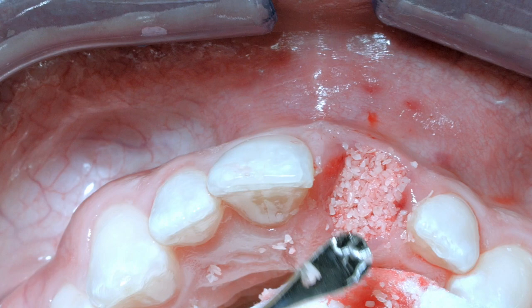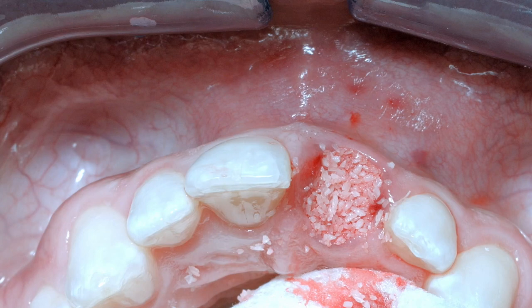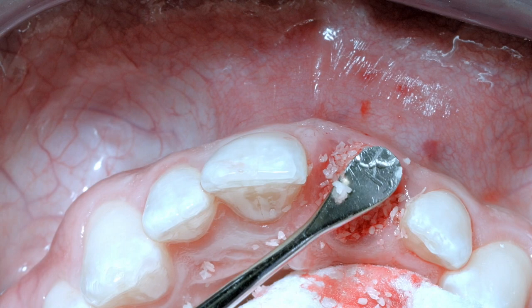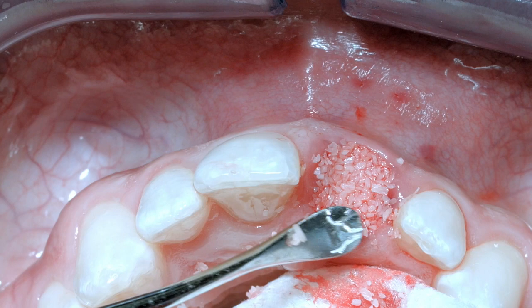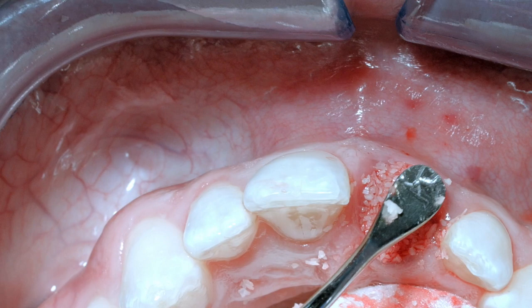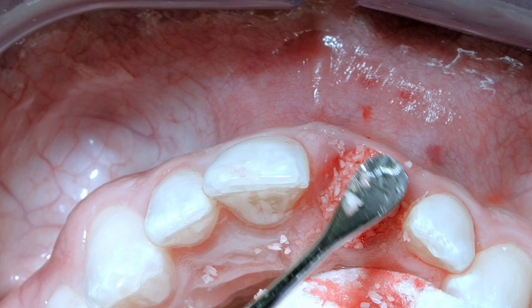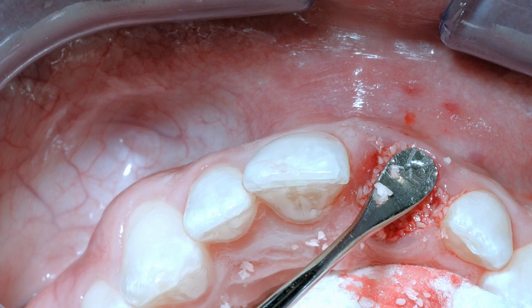For this patient, we'll utilize an Essex appliance with a laboratory-fabricated denture tooth for adequate aesthetics, but it is an appliance that doesn't put pressure onto the ridge — unlike a flipper appliance, which I would prefer not to use. Here we can see completion of bone condensation using the back end of a Buser elevator to gently pack the bone. Even in the edited video, you can see this is a time-consuming procedure requiring patience to slowly pack the material in place. I relate it to condensing amalgam — it builds on itself, and you wouldn't want to place the whole amount of bone at once without slowly condensing it onto itself.